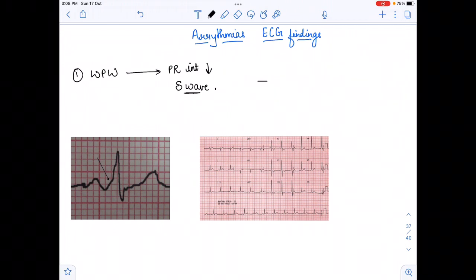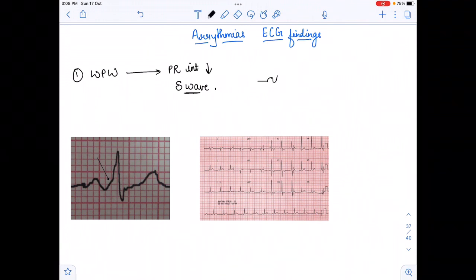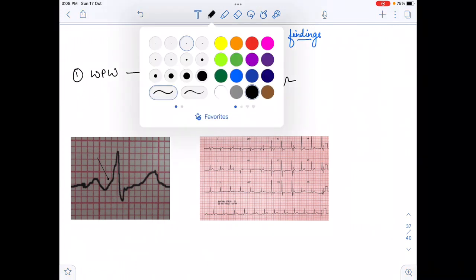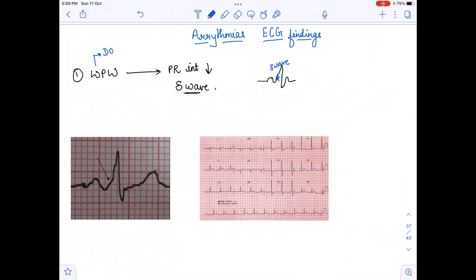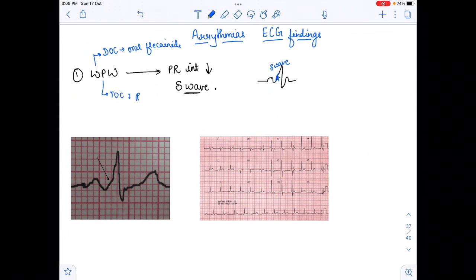In WPW syndrome, the ECG looks like this: after the P wave there is a slanting before the QRS complex — this slanting is the delta wave. Please remember: the delta wave is seen and the PR interval is decreased. The drug of choice for WPW syndrome is oral flecainide, and the treatment of choice is radiofrequency ablation.